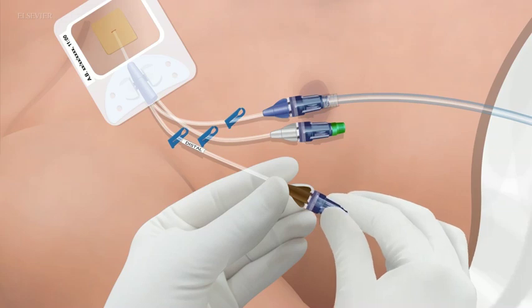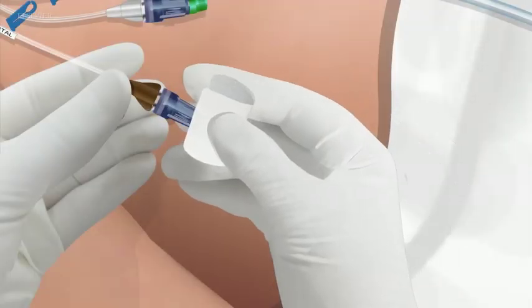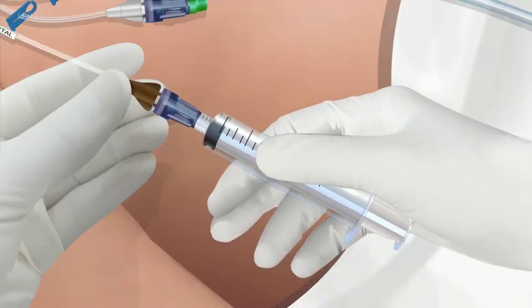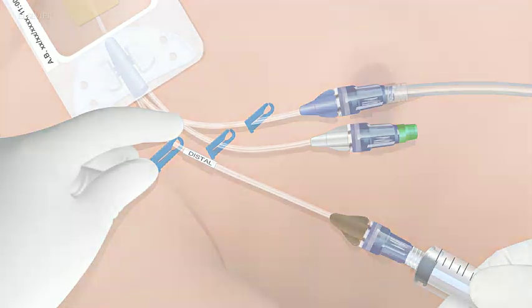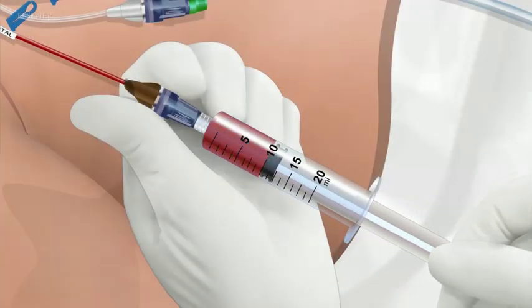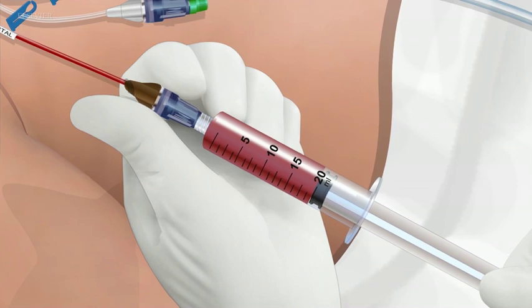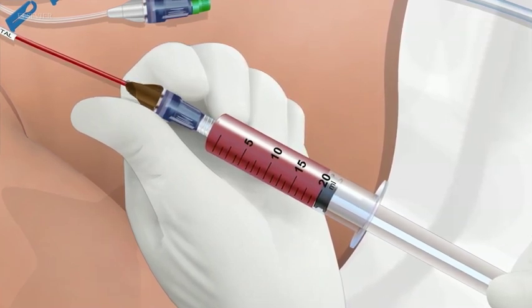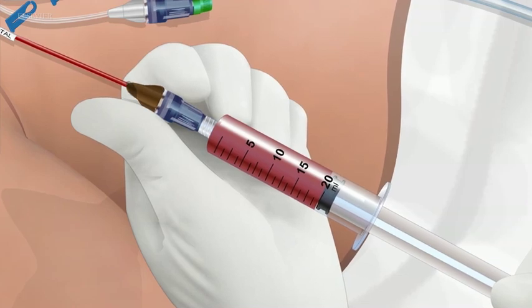Change the needleless connector cap using aseptic technique. Ensure that no air enters the system. Disinfect the needleless connector according to the organization's practice. Allow it to dry completely. Attach the appropriate size syringe to the needleless connector. Unclamp the port. Gently aspirate a minimum of 10 milliliters of blood per bottle for accurate results. Do not discard, waste, the initial sample from a CVAD.